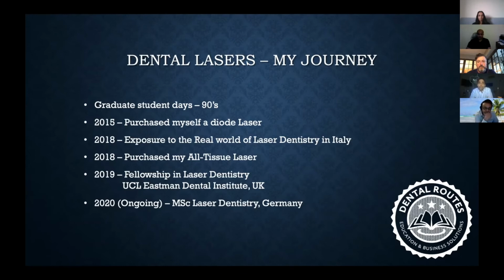This really caught my imagination, and I could see that there are a lot of challenges that exist in day-to-day routine dentistry that I could resolve by integrating this into my daily practice. I soon acquired a diode laser recommended by the course and started practicing laser dentistry. However, I should say I was disappointed with the outcome, as this type of laser was effective only in soft tissue management, and was not very useful in my routine day-to-day dentistry.